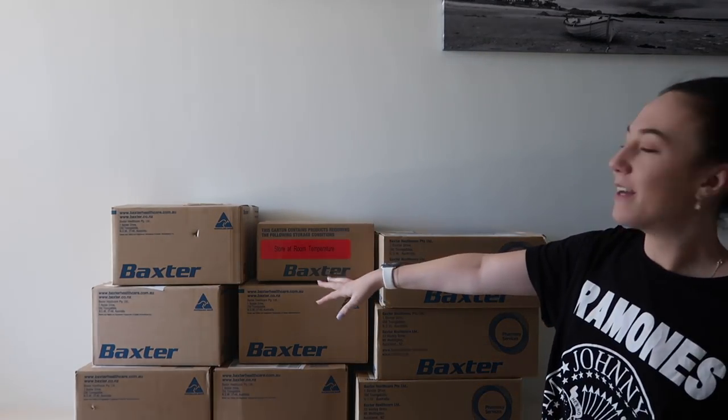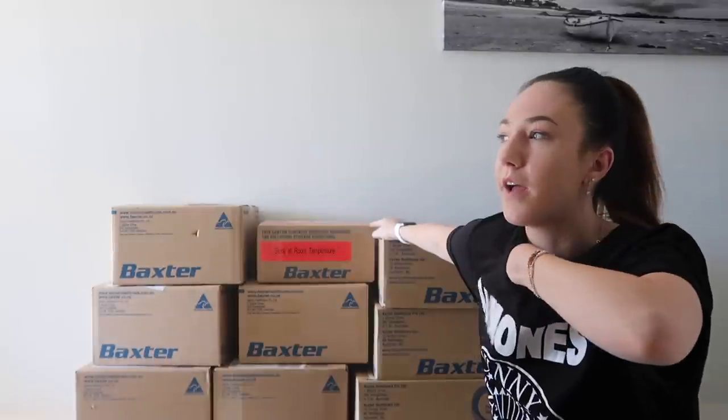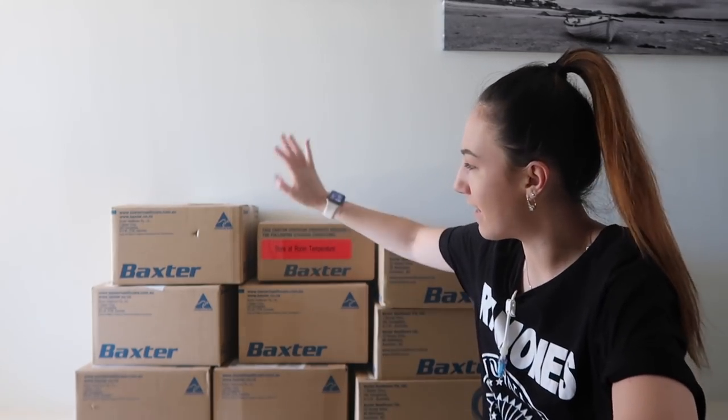So behind me we have nine lovely boxes. Two of them will be IV fluids. These three are TPN. This is my Taurolock, which is a blood thinner that keeps my line from clotting. It's what I inject when I'm not using it so the blood that goes in there isn't going to clot, and when I go to flush it it's not going to send a clot to my heart. Sounds dramatic, but anyway that's what that is.